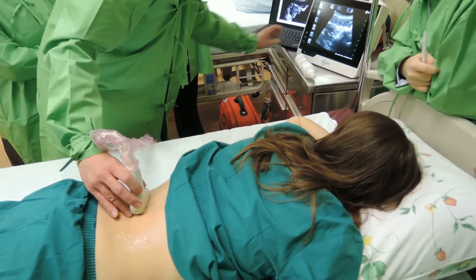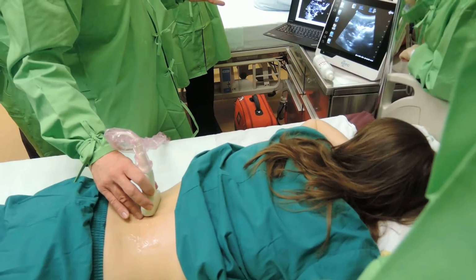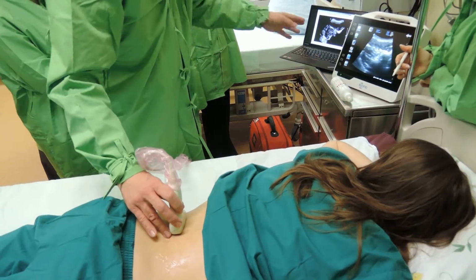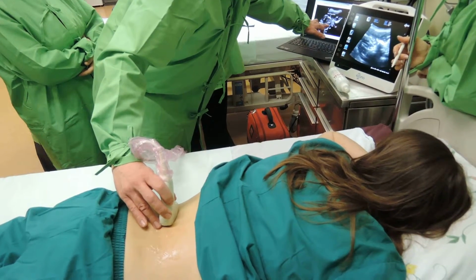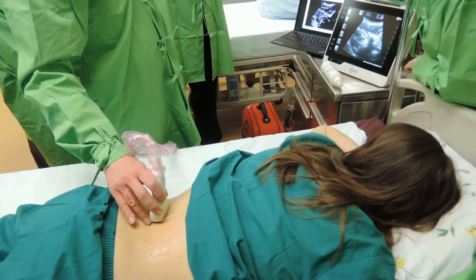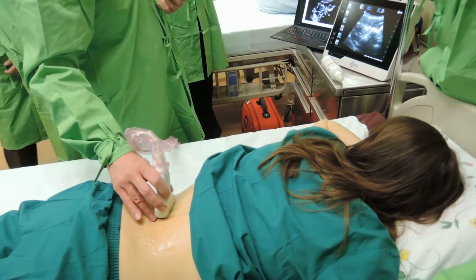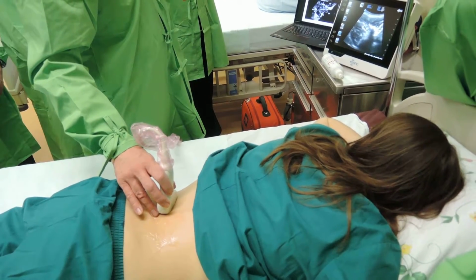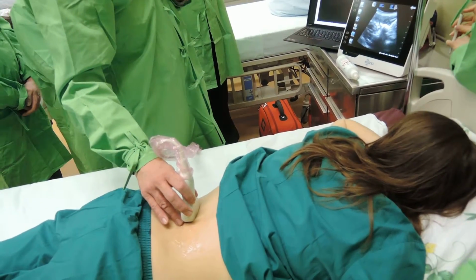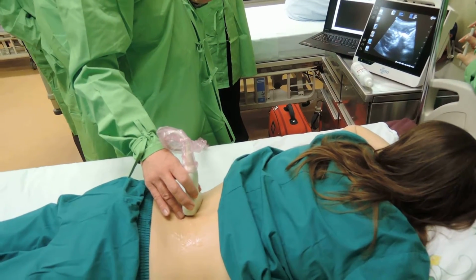I've got a video. And this is a video of a similar study. This is the view from oblique. And there's the psoas, the erector spinae muscle, and the bony structures. Ultrasound needs landmarks as well. Landmarks are what you need to look for.